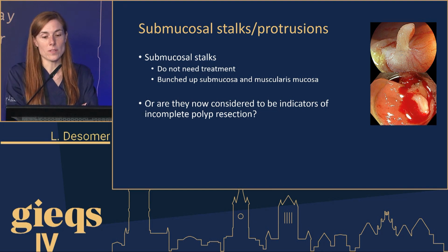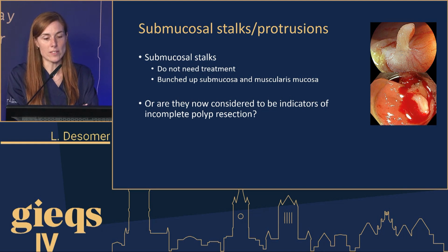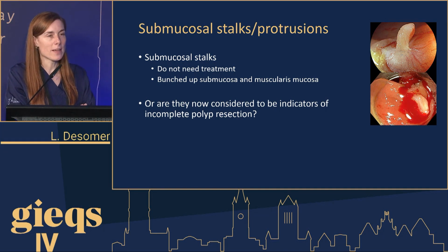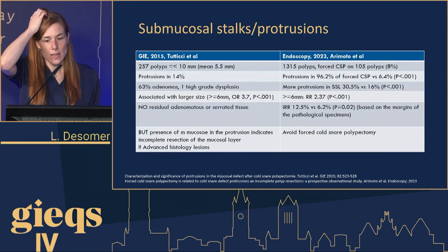So submucosal stalks or protrusions, there's a lot been written about that. We used to say they definitely do not need treatment. They're just bunched up submucosa, muscularis mucosa. But a recent study may have shown something a little bit different to that, actually.